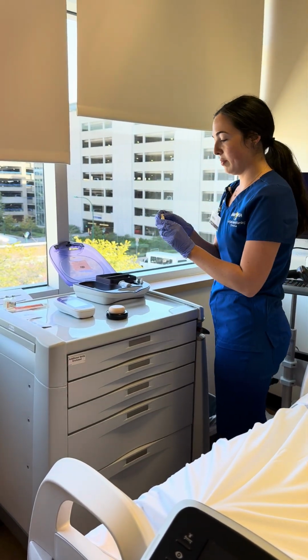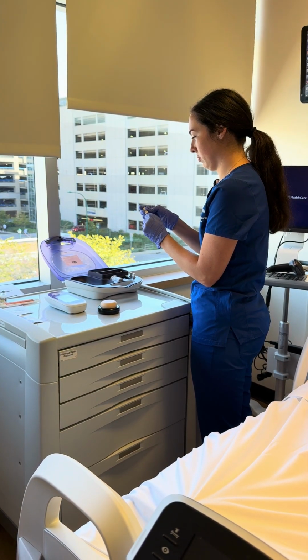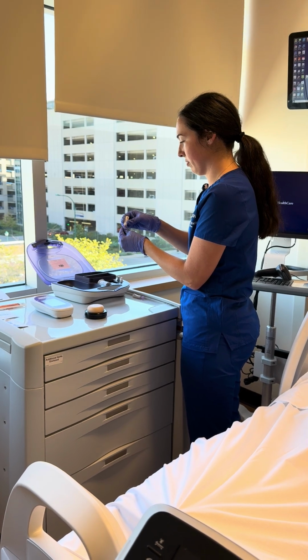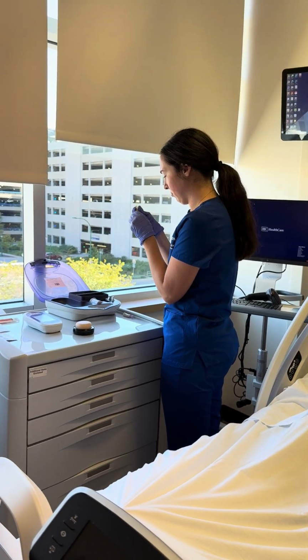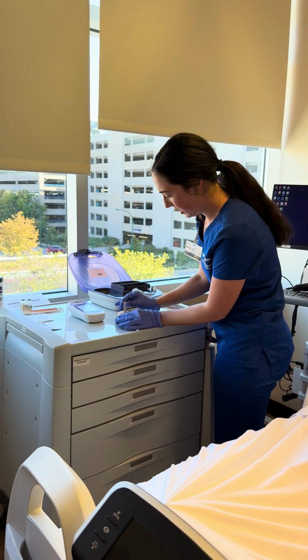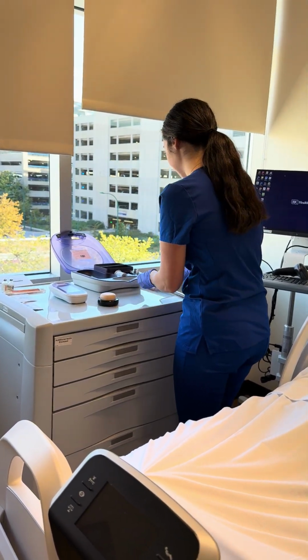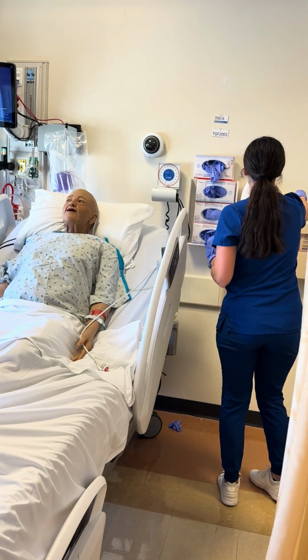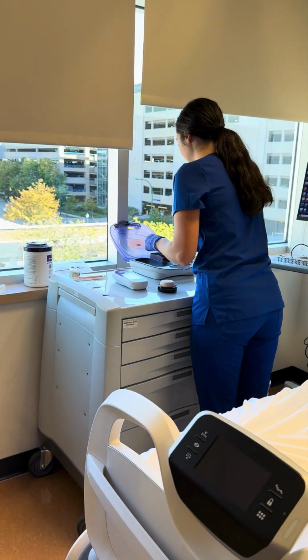Okay, I'm going to grab this here and twist off the purple cap and pull. You have to get a new one here. Twist off the cap and pull the cap off. Okay. All right, so now I'm going to grab the area and push down. Perfect. Okay. I'm going to dispose of that into the sharps bin over here.